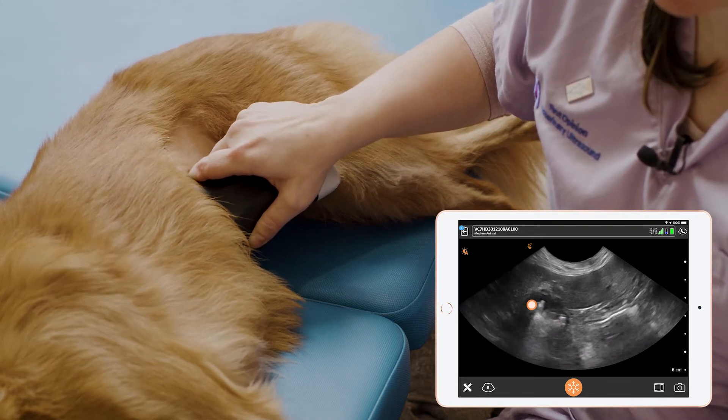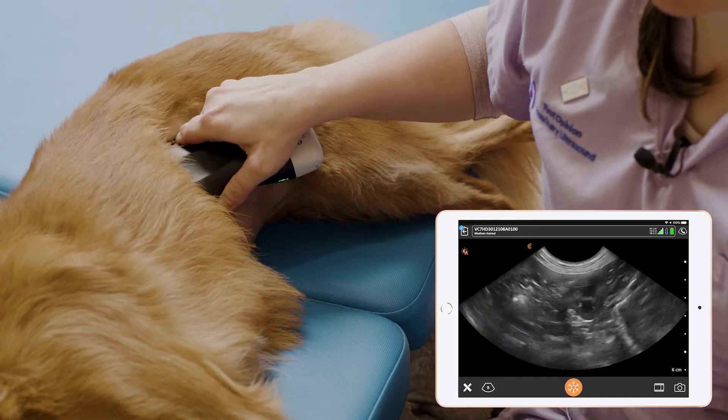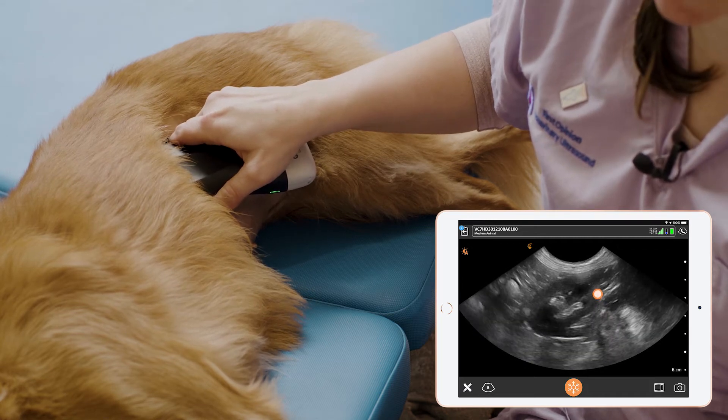We then see the stomach. The next organ we see is the spleen, and then finally, before we reach the lumbar musculature, we see the left kidney.